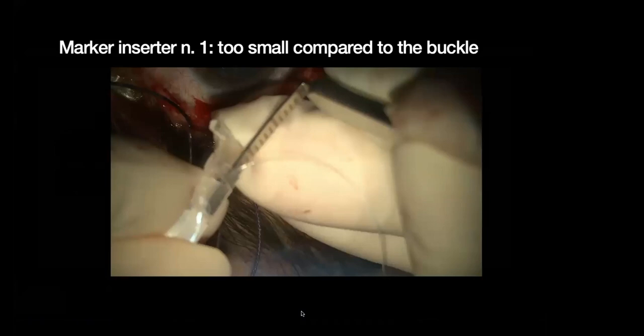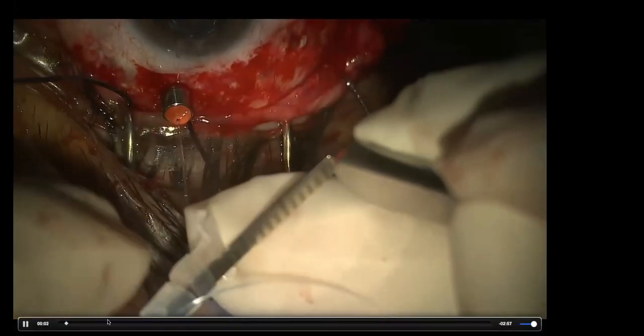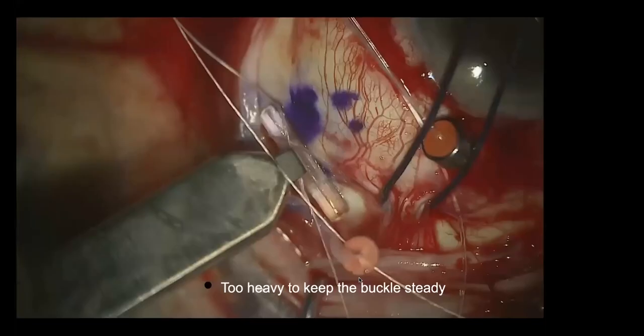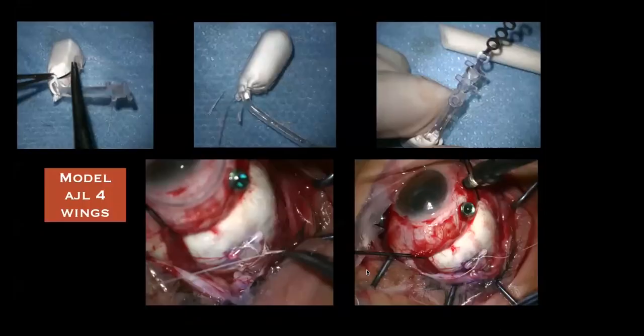I focused on different types of loading devices, always with the aim to improve the implantation. I will go quickly because I want to show you the new device, just to show you some history of everything that I have done in the past years.